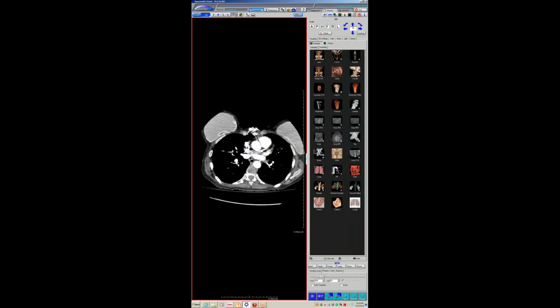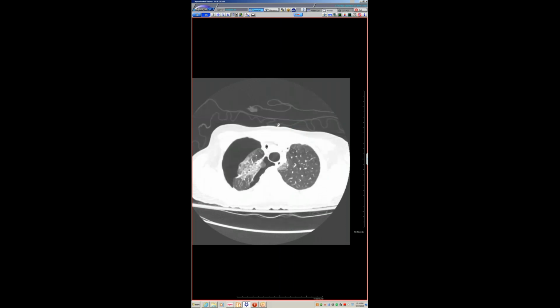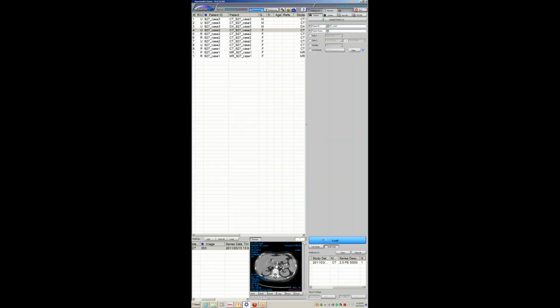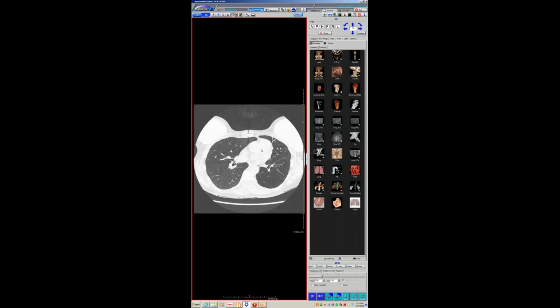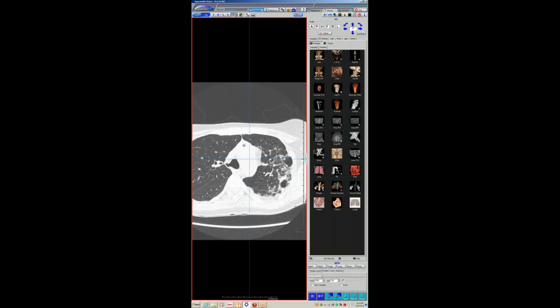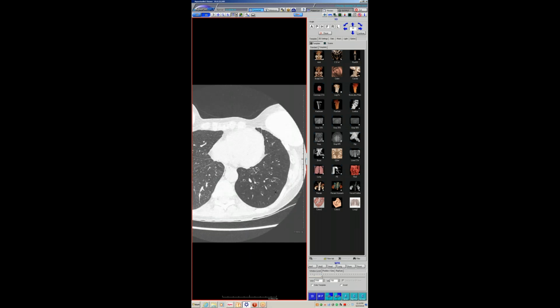So the process worsens here, and she undergoes a right lung transplant, and all they read it as is recurrent LAM in the right lung and some fibrosis. That's all they say. Not very interesting. So here she is, now she has that recurrent LAM, that's path proven. But then she's developing this scarring with perilymphatic nodularity, at least in my mind, looks pretty perilymphatic, in the left upper lobe.